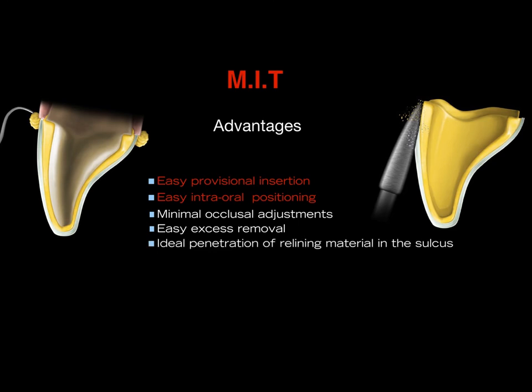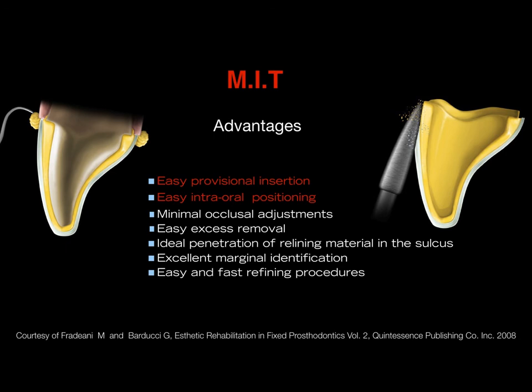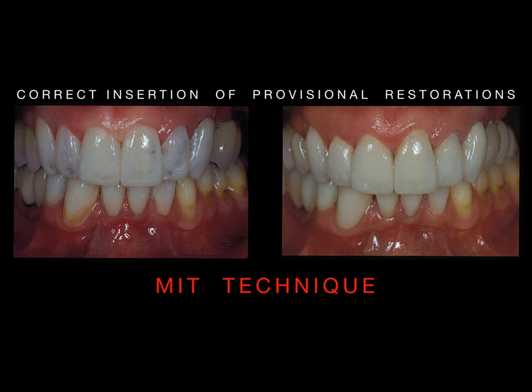And then, remember, this cervical enlargement of the shell, this enlarged cervical third, works and acts similarly to the customized tray during the impression procedure. So that's the reason why you can say that you have an ideal penetration of the relining material into the sulcus, an excellent marginal identification, and of course, working on subtraction, you have an easy and fast refining procedure.